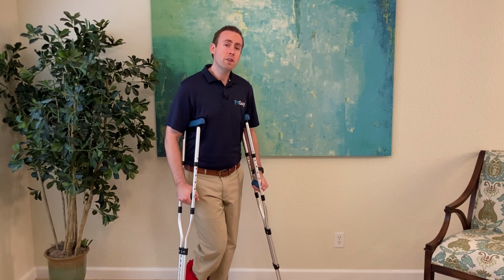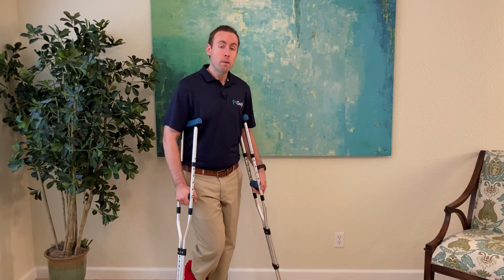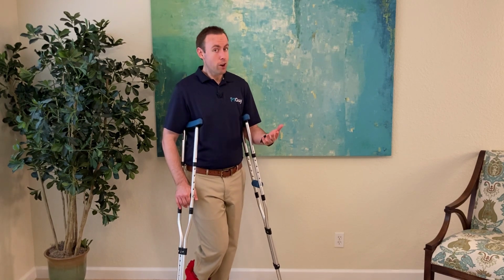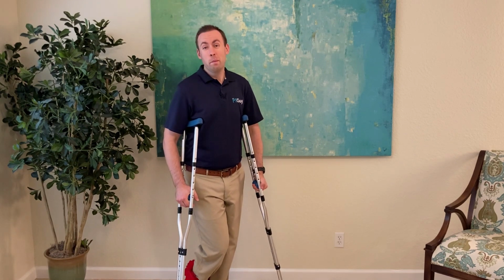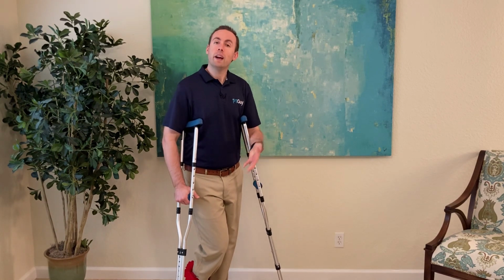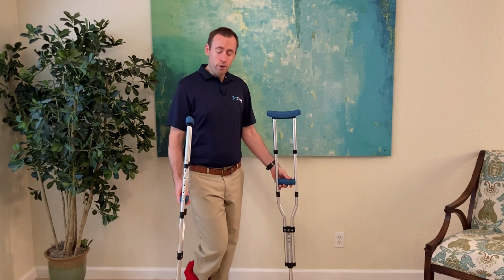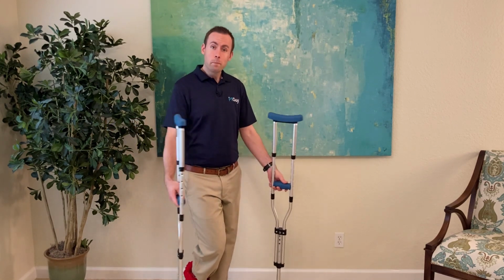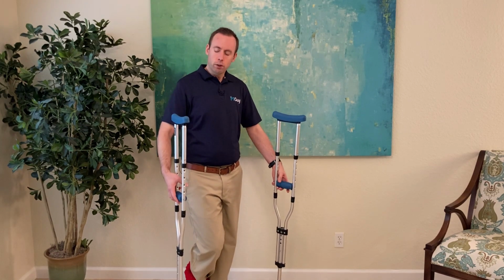What happens if you can't put any weight at all through that hurt leg? Maybe you broke your ankle, like I did when I decided to kick a soccer ball on rollerblades. Not smart. Or maybe you hurt your meniscus, or you have some injury in your knee. Either way, you're not allowed to put any weight through that leg for some time. Well, you still need to move around, and you're using crutches. If you're using crutches to get from point A to point B and you can't put weight through that leg, this is how you can do that a little bit safer.